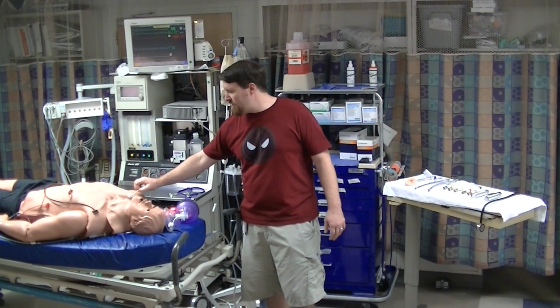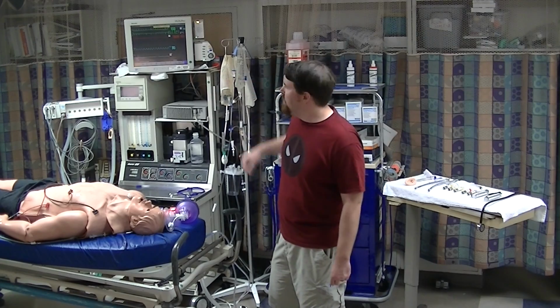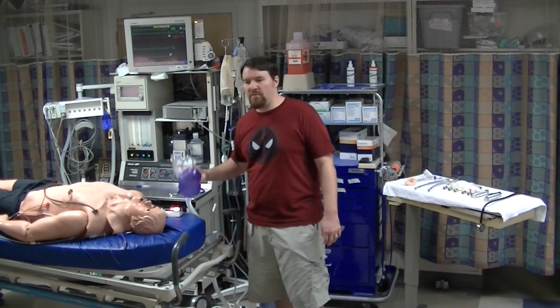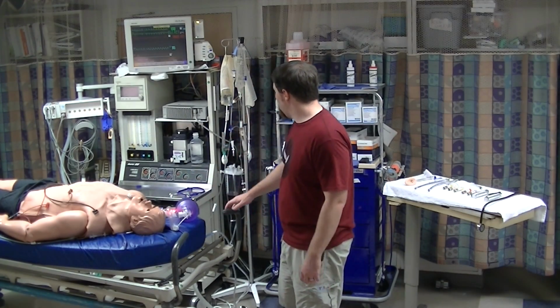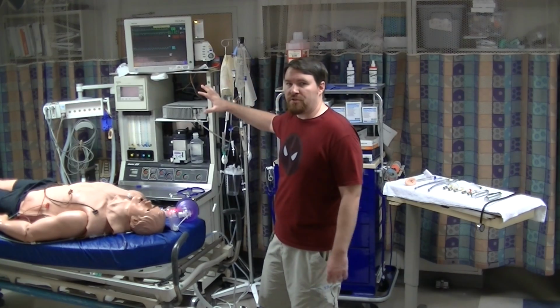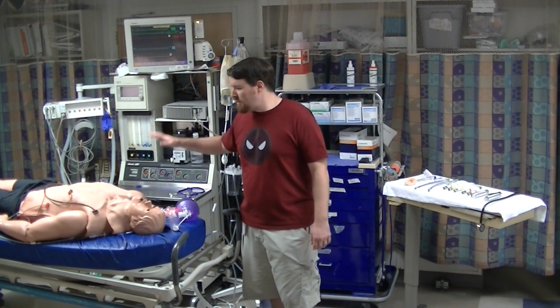First off, he's got lead placements for EKGs. He's on his monitor. He has oxygen normally would be running either through a nasal cannula or a non-rebreather mask, or possibly being non-invasively ventilated through a bag valve mask. He has fluids hanging in his IV. So those are the things you need to know, all of this, long before you ever start to perform any sort of exam or skill on a patient. You need to know all of this is running.